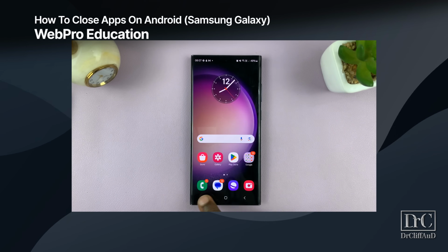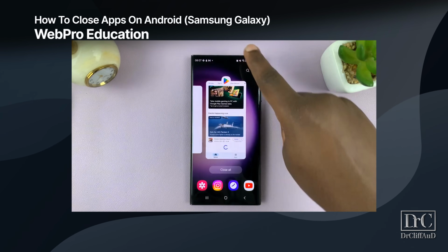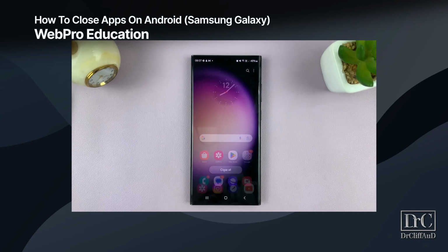Annoyingly, you will need to swipe out of each app individually, which can be a little bit of a tall order depending on how long it's been since you've completed this last. On an Android, this is done by selecting the button with 3 lines and completing the same swipe up motion for each app, or simply closing out of all of the apps at once.